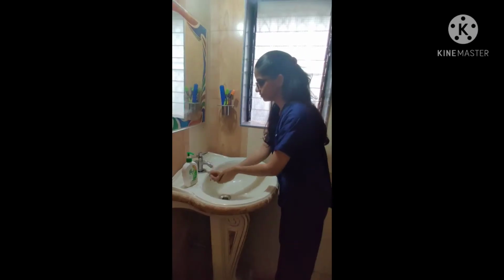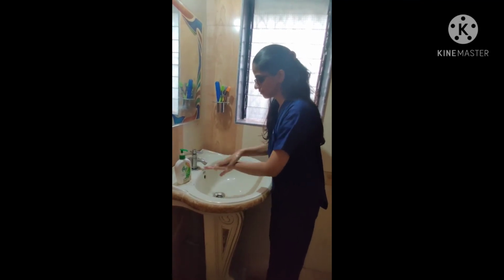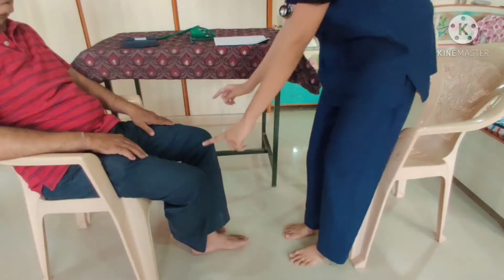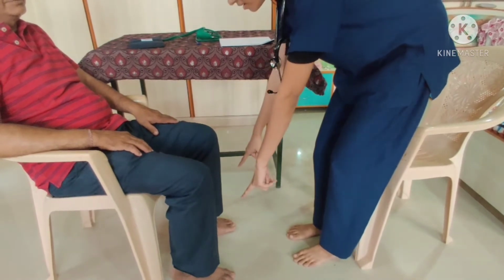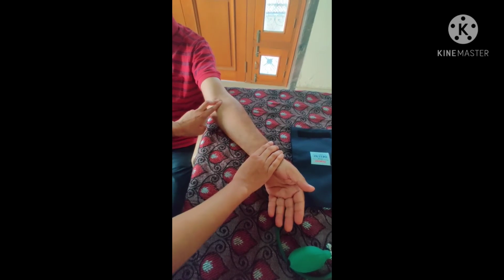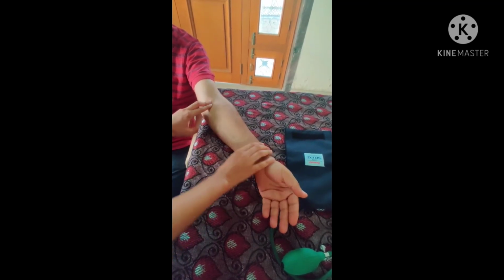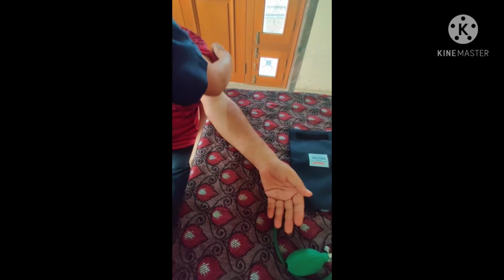With the patient history in mind and good hand hygiene, I am ready for the examination. The patient should sit quietly for 5 minutes on a chair with feet on the floor and not crossed. Palpate the brachial artery to confirm a viable pulse and position the arm so that the brachial artery at the antecubital crease is at the heart level. Rest the arm on a table. Roll the sleeves to make sure the arm is free of any clothing.